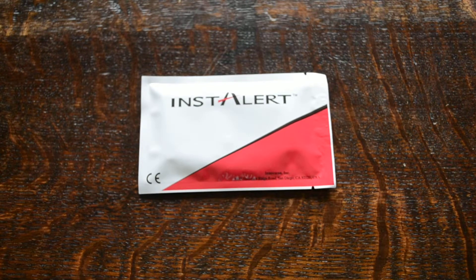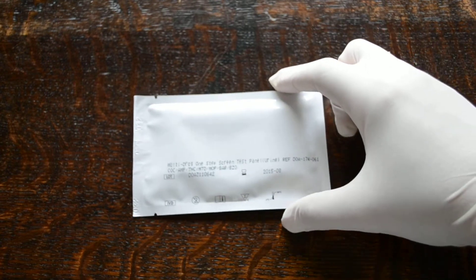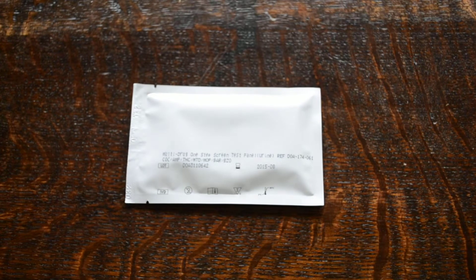This Instalert seven panel is a combination intended for drugs teams. You'll see it's a good combination for drugs of dependency — it's got cocaine, amphetamine, cannabis, methadone, opiates, barbiturates and benzodiazepines. So it covers seven common dependency-inducing drugs with the addition of cannabis.